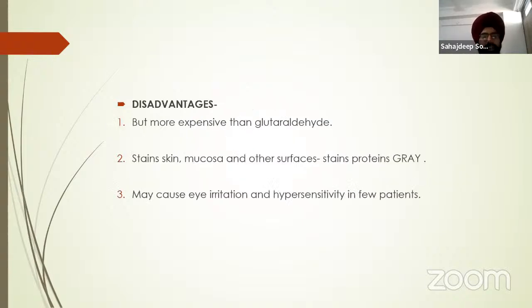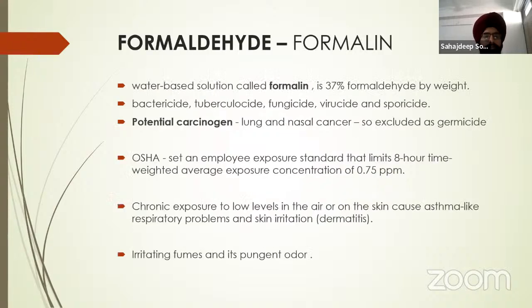The disadvantage is it is more expensive than glutaraldehyde. It stains the skin and mucosa because it stains the proteins with gray. That is why it can lead to staining of skin and mucosa in patient. And sometimes it causes hypersensitivity or eye irritation in few patients.